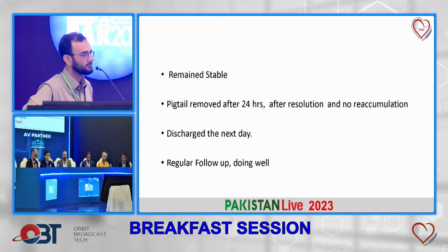When your hardware is out, one important question is that we don't have any data: if you use a covered stent or multi-layer stent, should we go for clopidogrel or should we go for ticagrelor? Would you like to take this question?